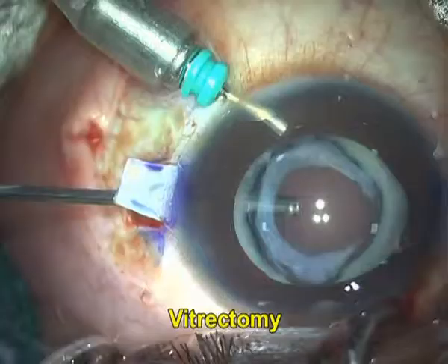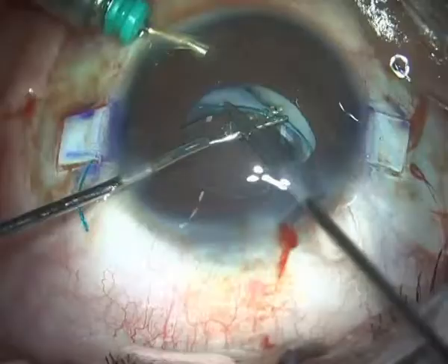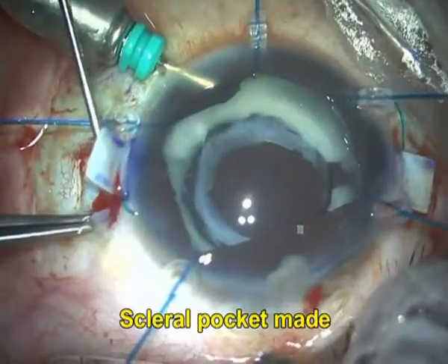Performing a complete anterior vitrectomy and placing my glued IOL lens inside the eye. Externalizing both the haptics, making sure my scleral pockets are made and the haptics are now tucked in.